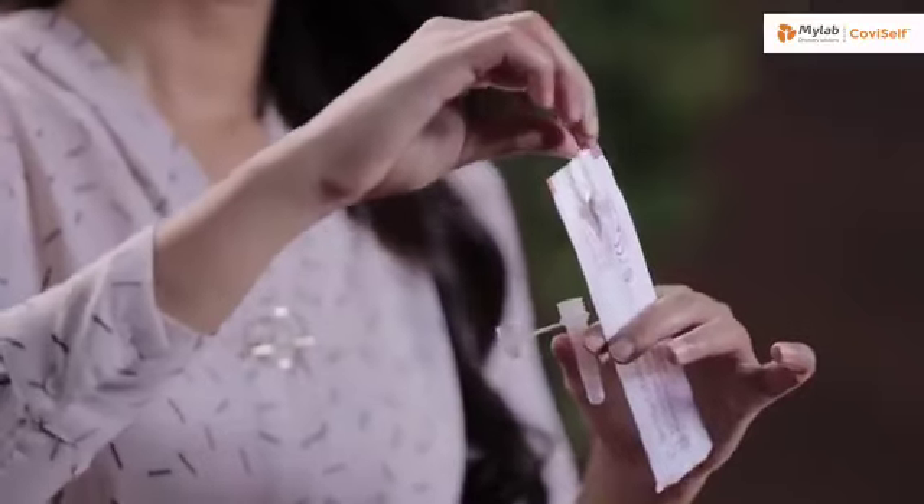Tear it from the tail end. It's important that you do not touch the swab head. Carefully insert the sterile nasal swab in both your nostrils one after the other up to 2-4 cm or until resistance is met. Roll the swab five times inside each nostril. Your nasal swab is now ready for the test.